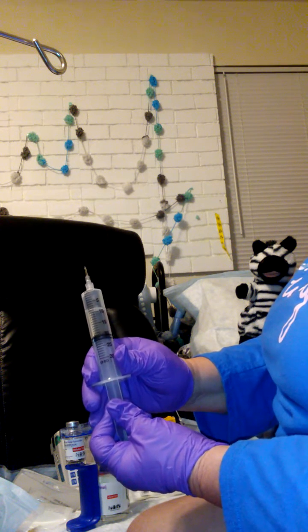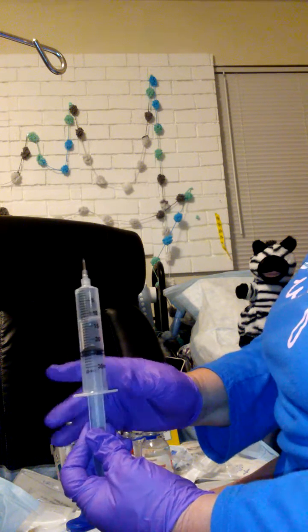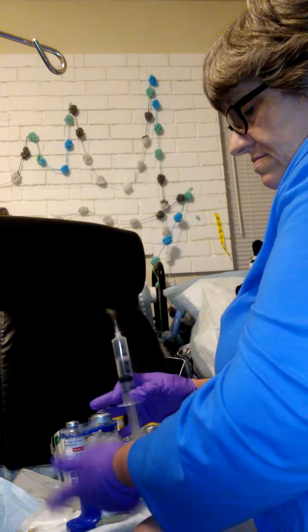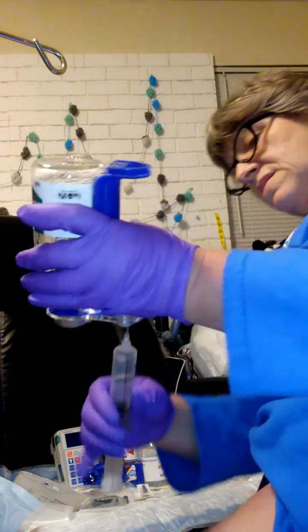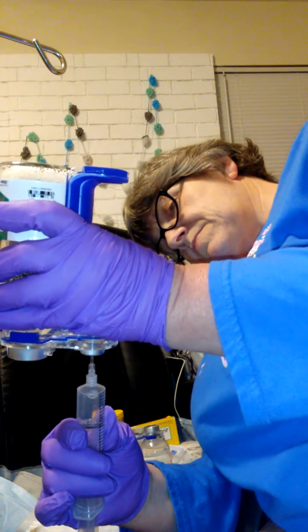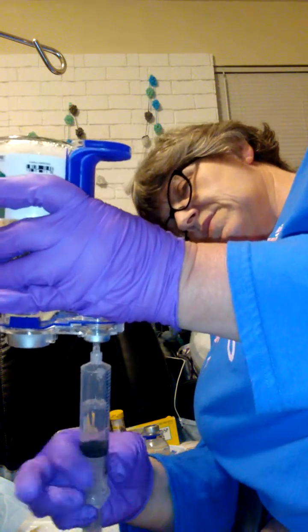Got to get this new bottle of HyQvia. We're going to take this top off. Just twist this off and pull up. Okay, we still have a little air in there. I'm going to give it a little more air so that we can draw the rest of this HY out. And I'm going to just go ahead and flip that so you can see what we're doing here. Just push that straight up in there.